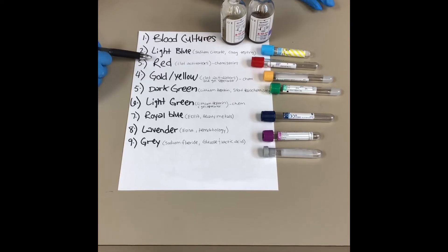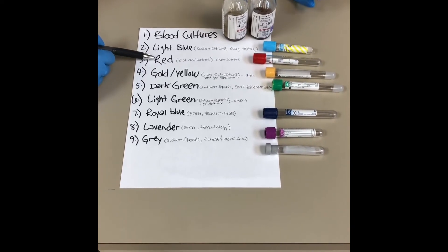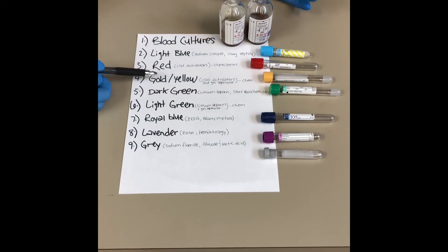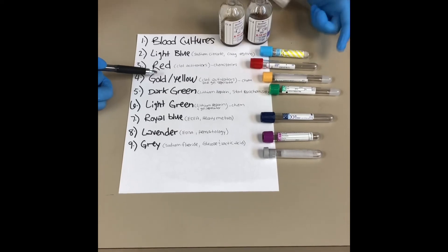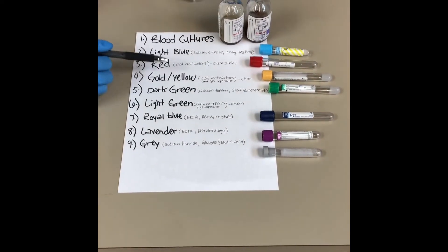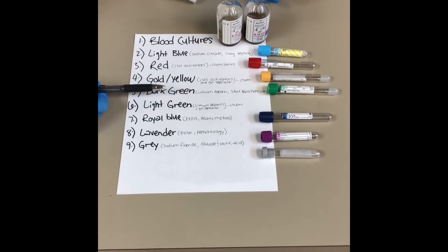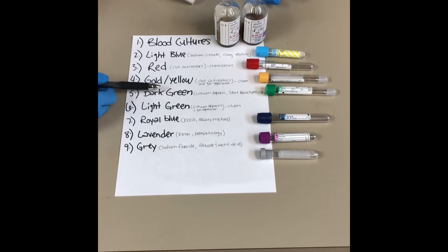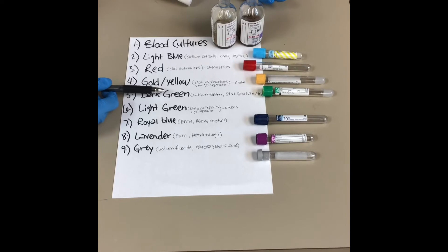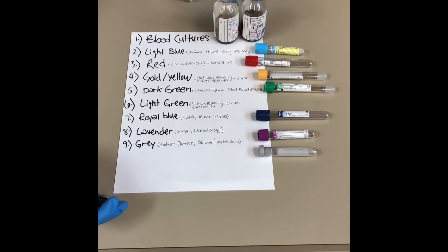The next one is red, which is typically a plain tube — it only has clot activators and can be used for most general chemistries. The same thing with the gold, except it usually has a gel separator in it that separates the serum from the cells, and it's also used for chemistries. The dark green is very similar as well, except it has an anticoagulant — lithium heparin — which produces plasma instead of serum. We use the dark green for stat chemistries typically.